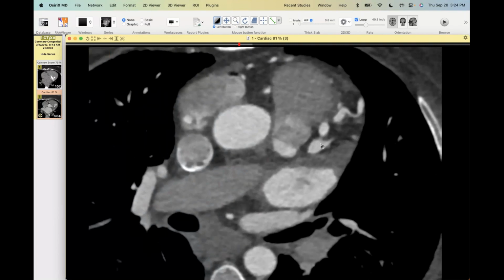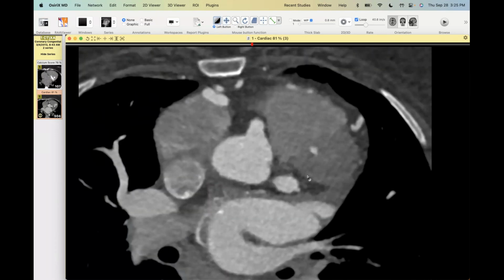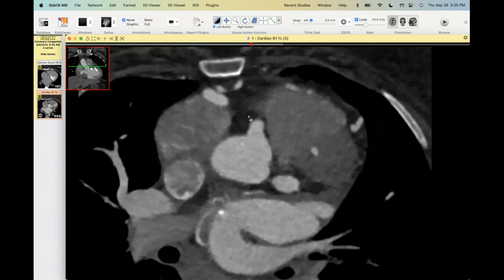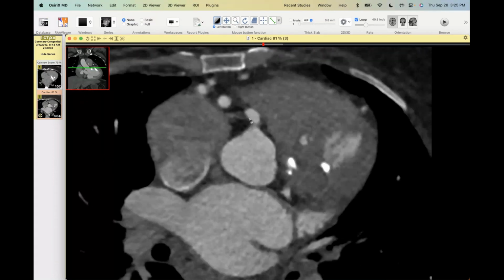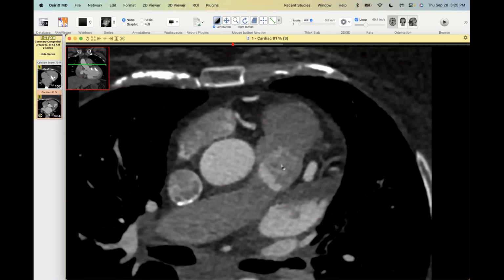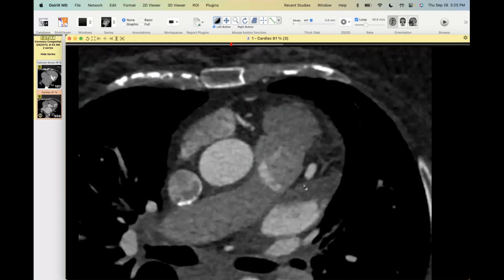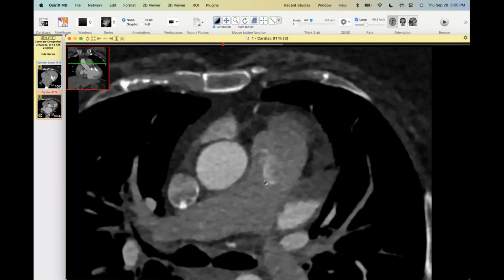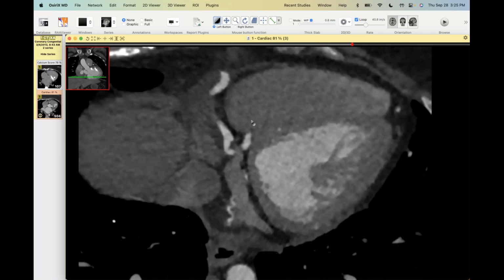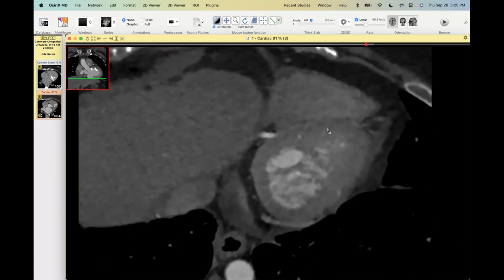This is a patient who had chest pain and underwent a stress test that was abnormal. I can't remember what else, but it eventually led to a cath and coronary CT. There are typical findings of a fistula, which is essentially what this is: blood flowing down a pressure gradient. You've got systemic pressure here and pulmonary artery pressure here. Over time that increases flow, and you end up with a steal phenomenon, with blood flowing backwards from the left coronary into the pulmonary artery, as you can see with the direction of the contrast in that jet of opacified blood. No surprise, this patient has a lot of macroscopic collaterals; you'll see some of the septal perforators communicating with the left side.